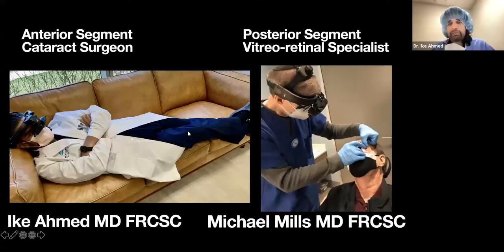And Michael, this is a bit reassuring. We've got about 90% of folks using indirect ophthalmoscopy. Any quick thoughts on that? Well, we all know that's a great technique, and with the appropriate device and some practice, a dilated pupil, and a cooperative patient, we can get a great view of the important structures in the posterior pole and the periphery, and it's very important to be able to do it. And I'm glad to hear that so many people are making good use of it.